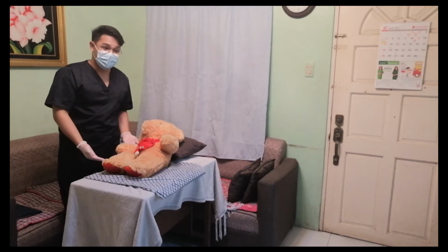And after that, the nurse on the other side of the bed should position his or her hands on the patient's shoulder and the patient's hip, assisting in rolling the patient to the side. And after that, we will be instructing the patient to pull the side rails of the bed at the same time. And after that, we will be using the friction reducing sheet to gently pull the patient over his or her side.